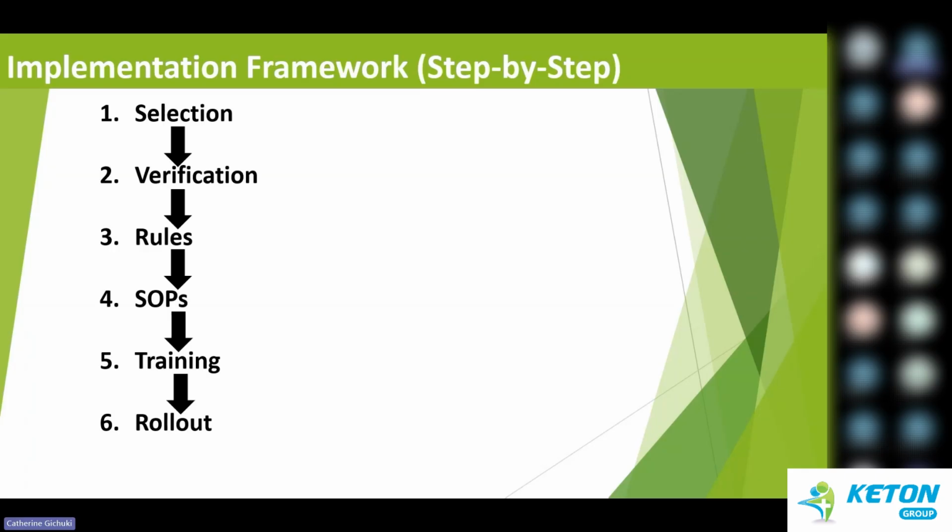You want to check what works for the platforms that you're using at that particular time. Then you verify. That is, you establish lab-specific means, CVs and SDs, usually done after an adequate number of runs. We'll be looking at it.